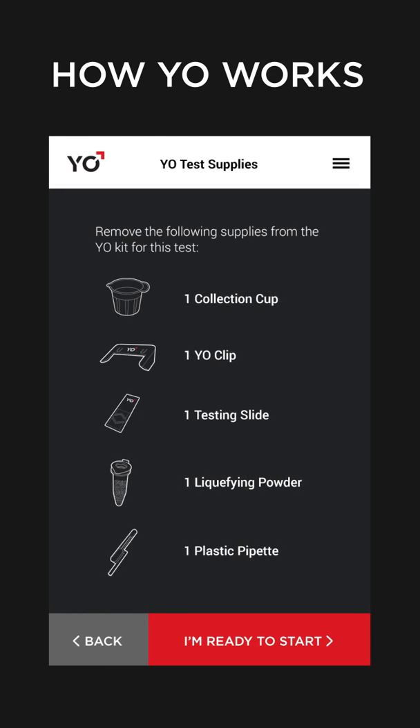Place the supplies for one test in front of you. Tap I'm ready to start.